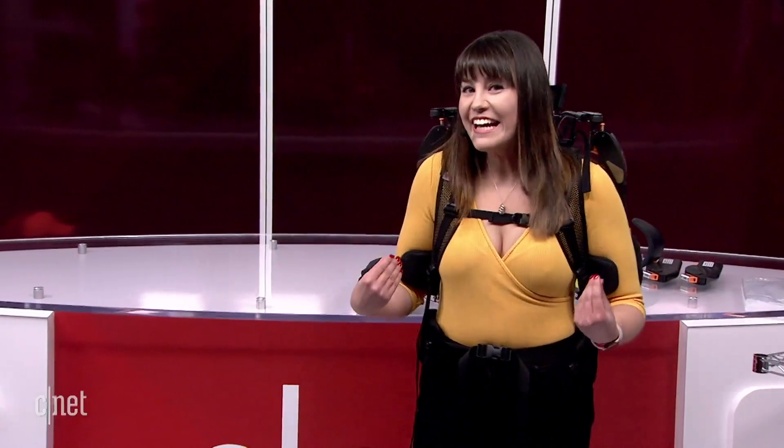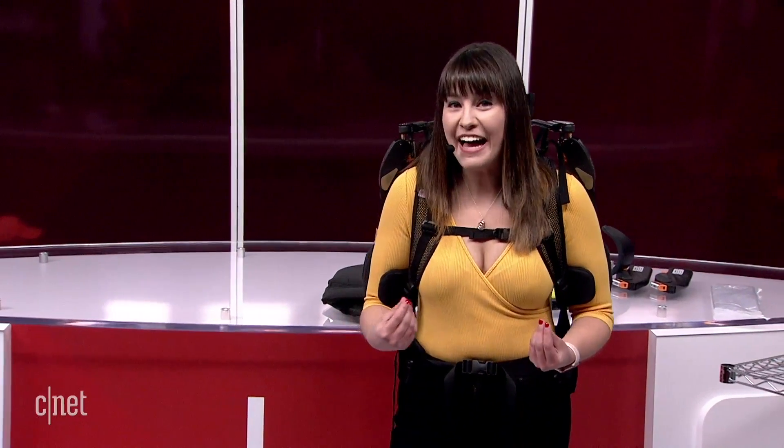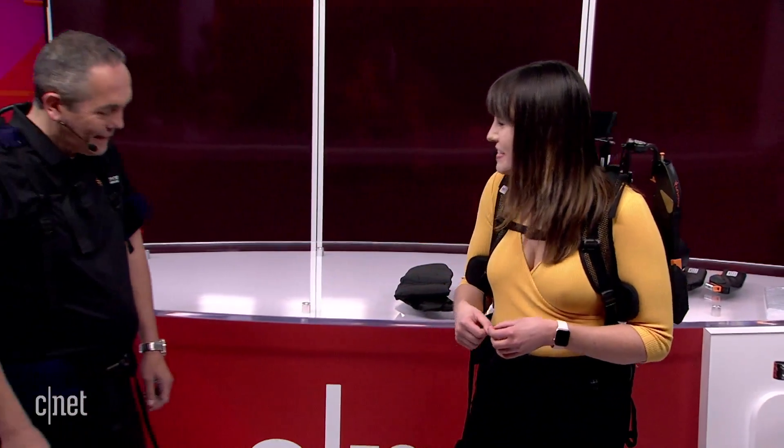If you're wondering what I'm wearing, it is an exoskeleton by Airframe — that's the name of the product — and the company is Levitate. I am joined by Joseph Sawida. Joseph, welcome to CES. Thank you so much for having us and thank you for bringing in this exoskeleton.